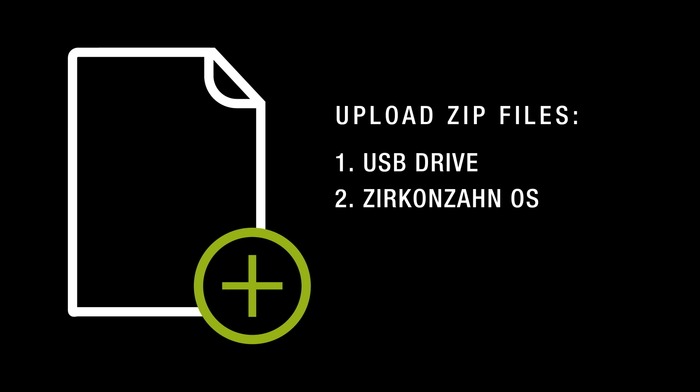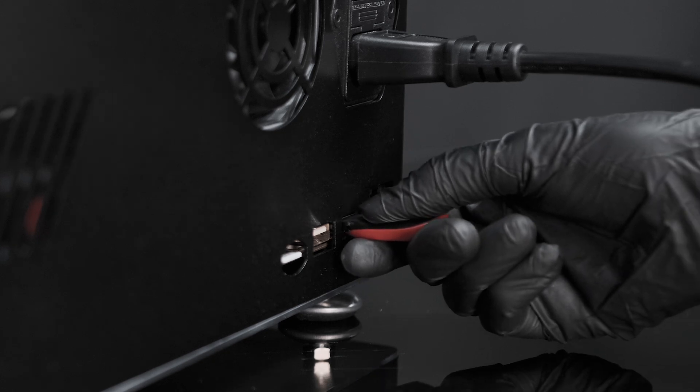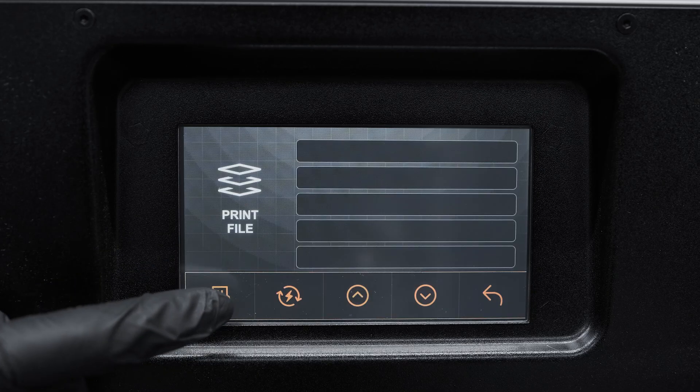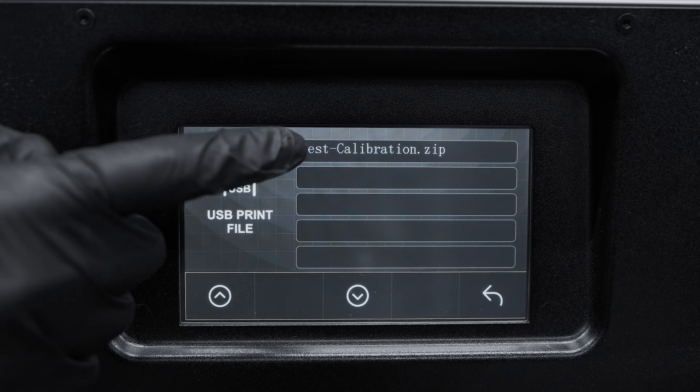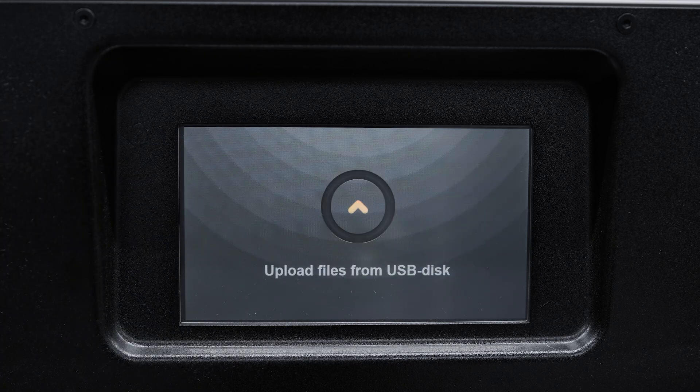You have three possibilities to upload zip files: via USB drive and via Wi-Fi through the Zirconzon OS website or the Zirconzon slicer software. In the first case, plug in your USB, select print, and choose the first icon on the left. Then click on the file, confirm by pressing yes, and wait for the uploading files.